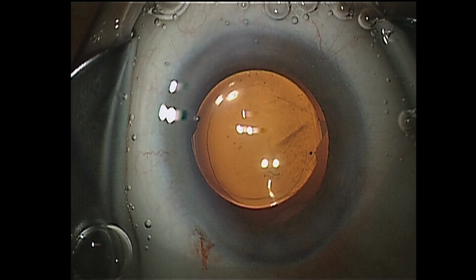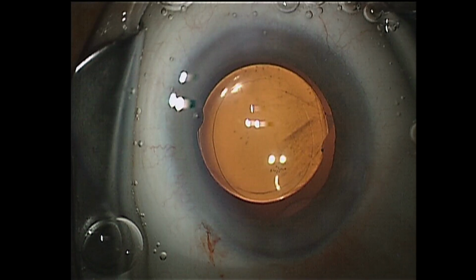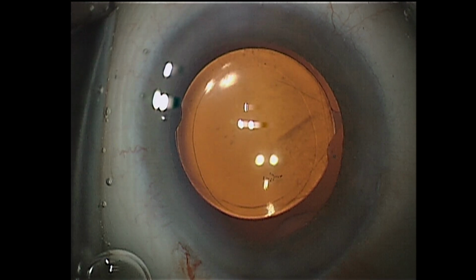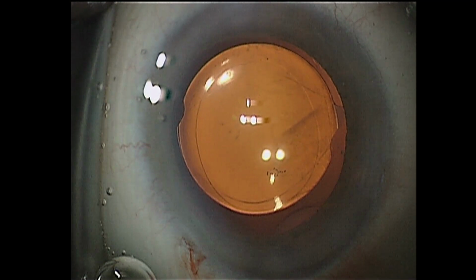The optic now centers within the posterior rhexis buttonhole, and the posterior capsule is seen to overlap the optic periphery while its edges undercross the haptic-optic junctions.